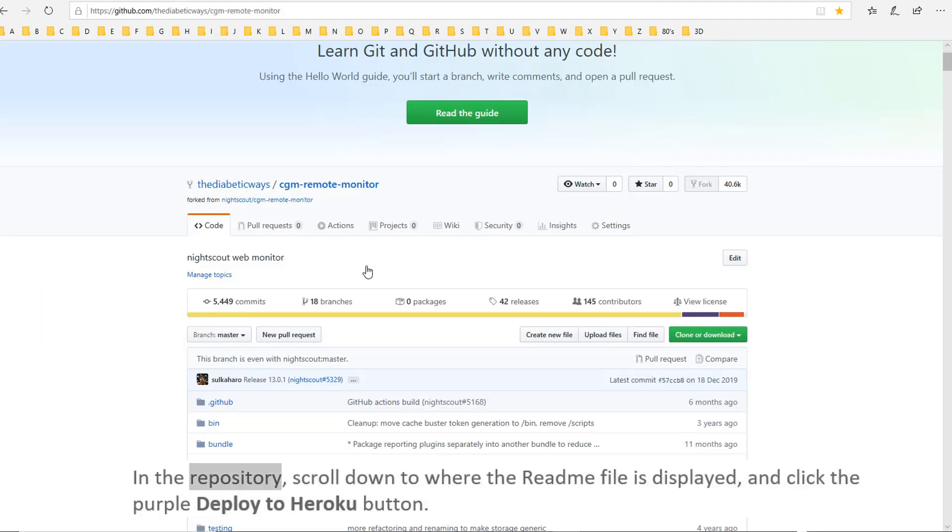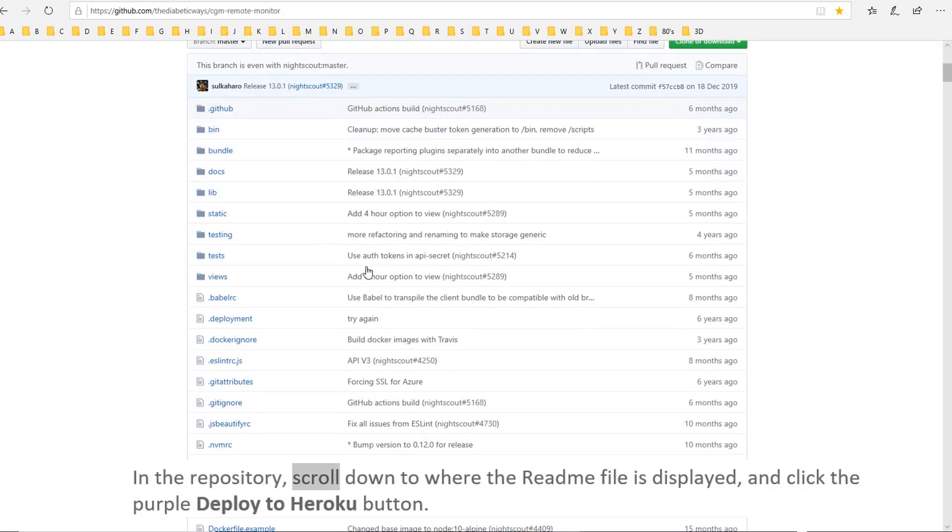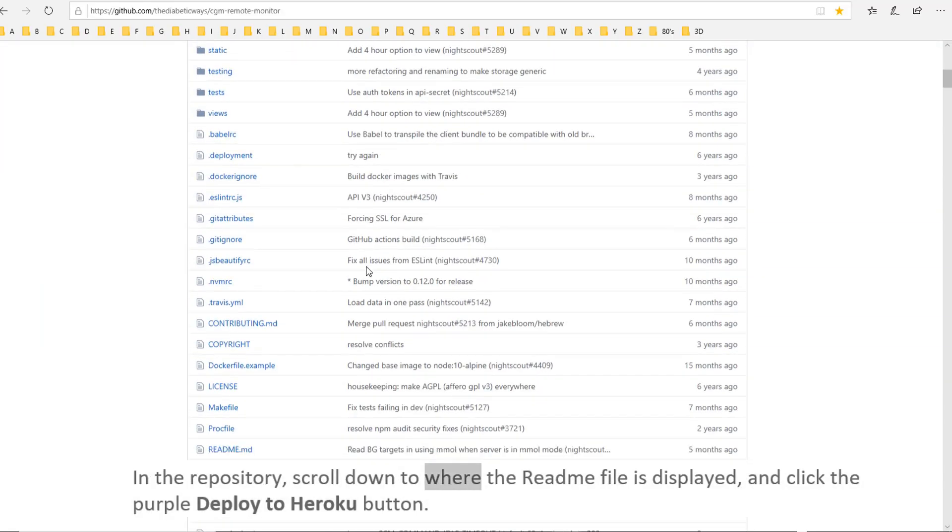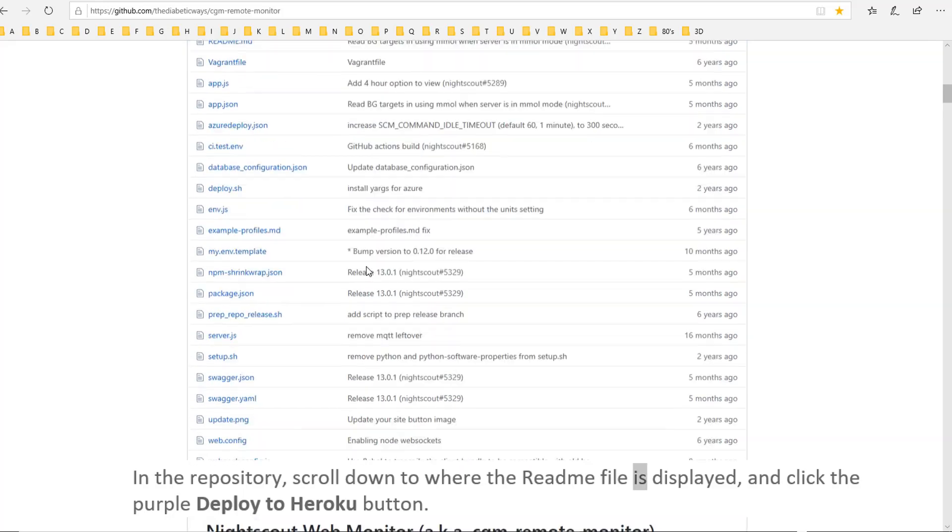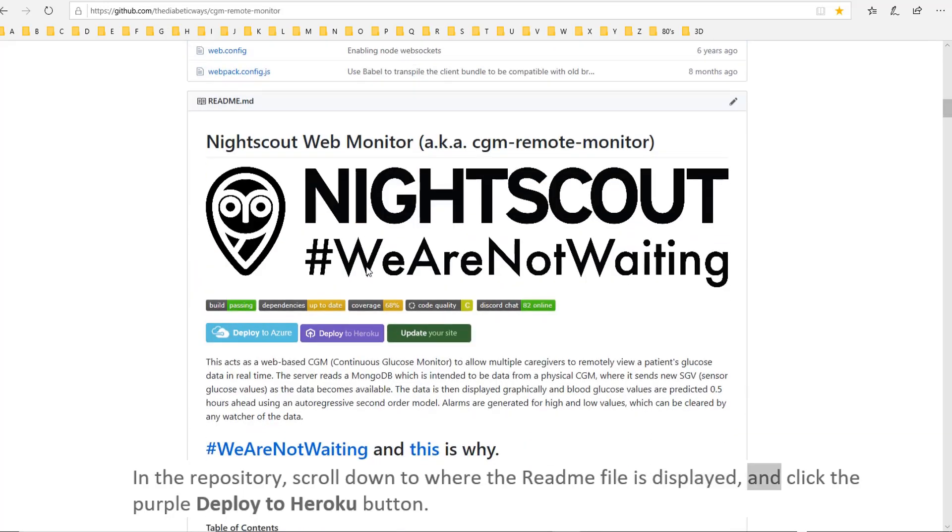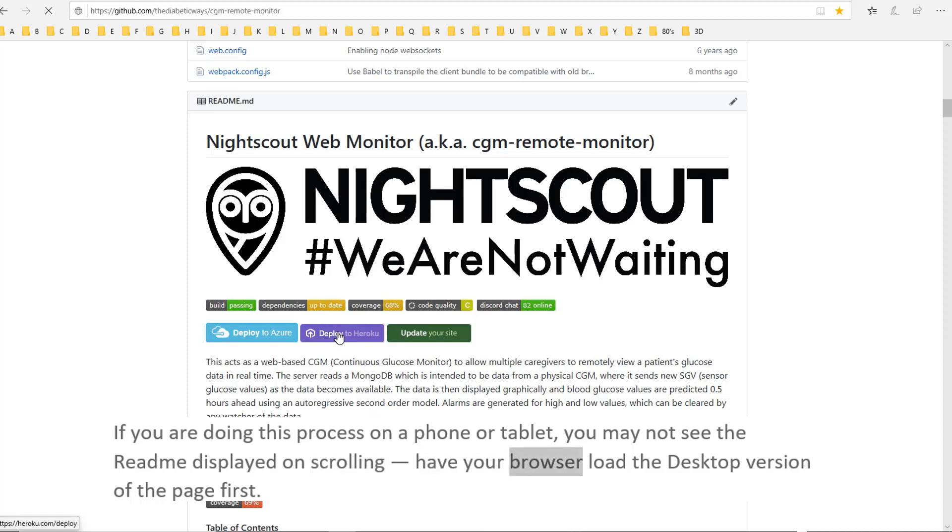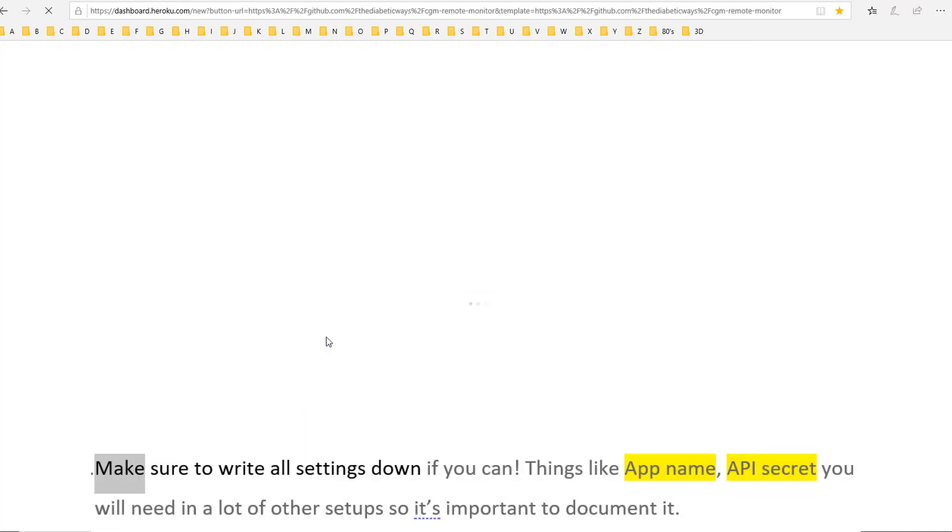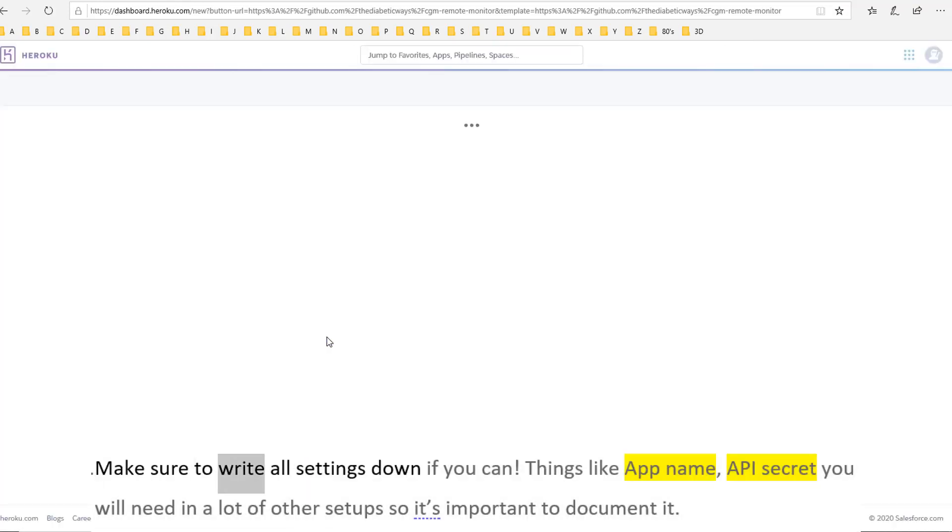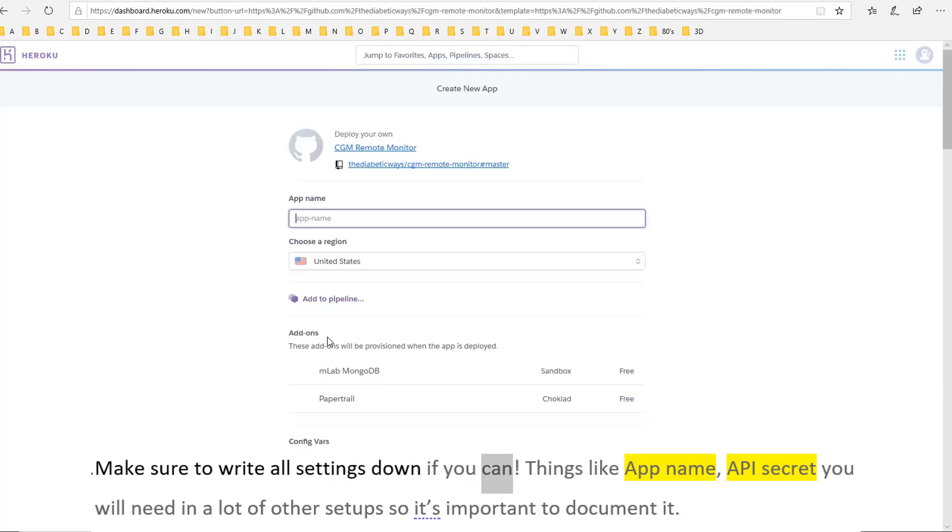In the repository, scroll down to where the README file is displayed and click the purple Deploy to Heroku button. If you are doing this process on a phone or tablet, you may not see the README displayed on scrolling. Have your browser load the desktop version of the page first.